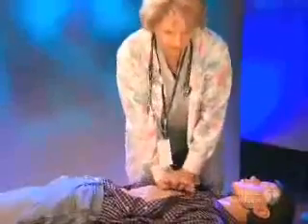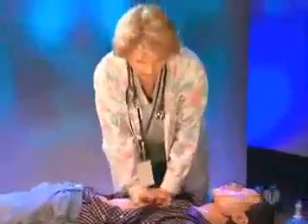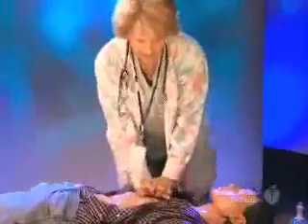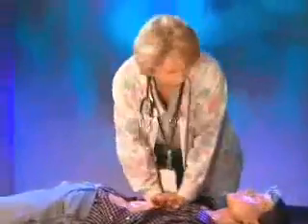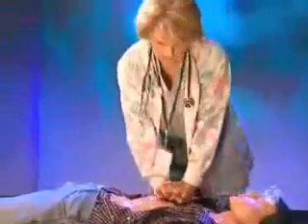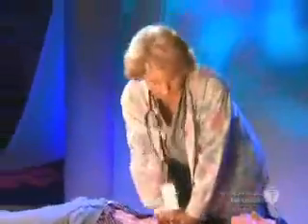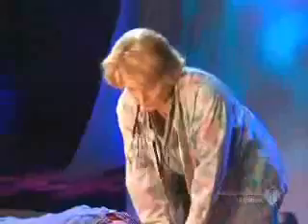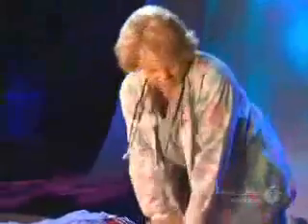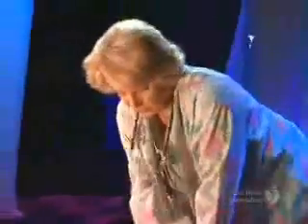Begin chest compressions, counting: 1, 2, 3, 4, 5, 6, 7, 8, 9, 10, 11, 12, 13, 14, 15, 16, 17, 18, 19, 20, 21, 23, 24, 25, 26, 27, 28, 29, 30.